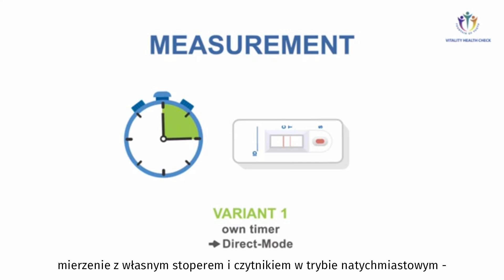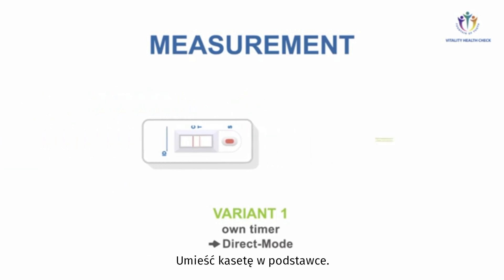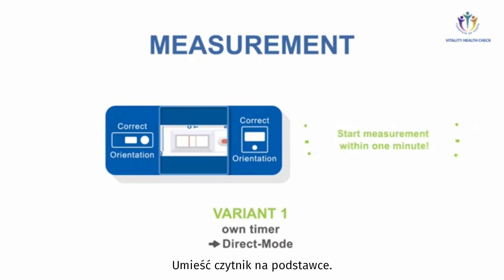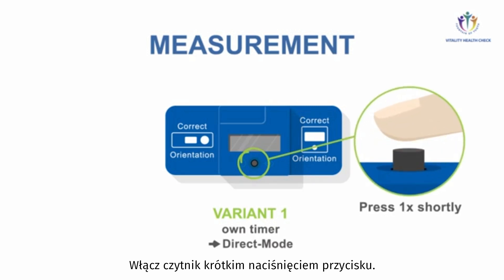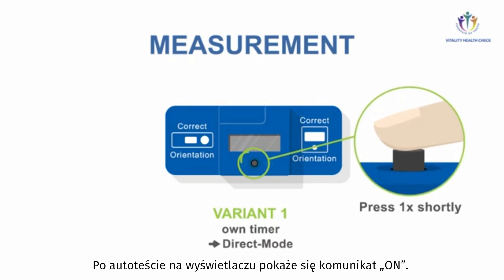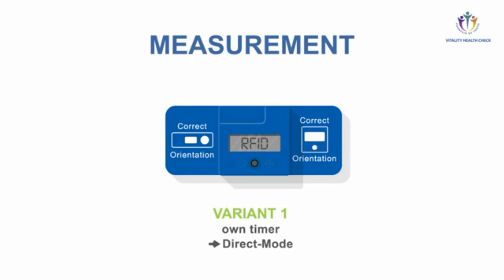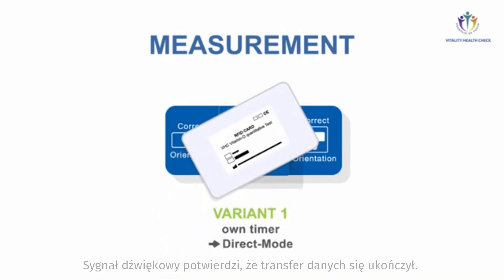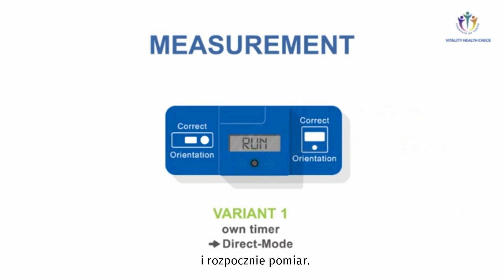In Variant 1, measurement with your own timer and VHC Reader in direct mode: perform these steps exactly after 15 minutes. Place the adapter on the test cassette, then place the VHC Reader on top. Check for correct orientation and turn on the VHC Reader by briefly pressing the button. After the self-test, the device shows 'on.' To start measurement, press the button shortly — maximum 1 second. The device shows RFID. Make sure the lot numbers of the RFID card and test cassette are matching. Place the RFID card on top of the VHC Reader — a beep tone confirms successful data transfer. The display shows 'test.' Press the button again shortly. Instead of a countdown, the reader shows 'run' and performs the quantification.